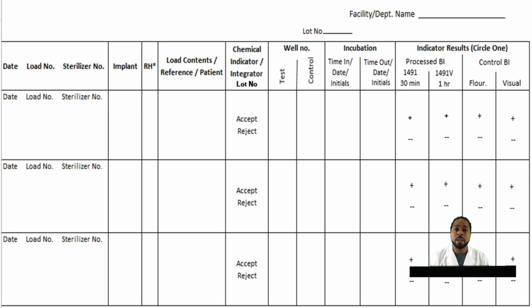So some of you guys may use a tracking system and some may also have paper documents. This is kind of the medium. If you have a tracking system, then this may help you out if your tracking system goes down, another means of recording your information. If you're using something else for your department in terms of paperwork, this may also be an option for you. So I'm just going to walk you guys through how to fill this out on a daily basis and how to do it correctly.